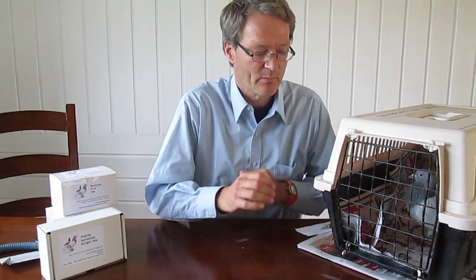Hello, my name is Niels de Ryder and I'm a bird veterinarian, especially interested in pigeons and other birds. I'm going to show you how to perform a test for salmonellosis in pigeons.